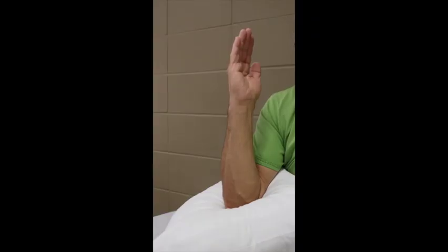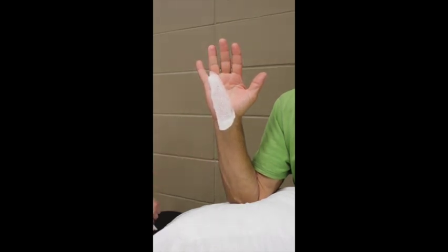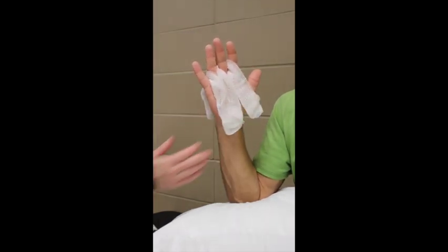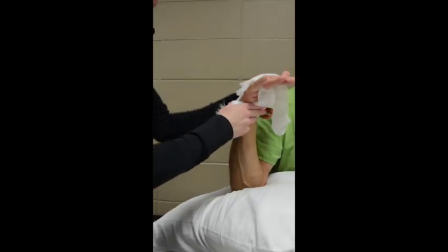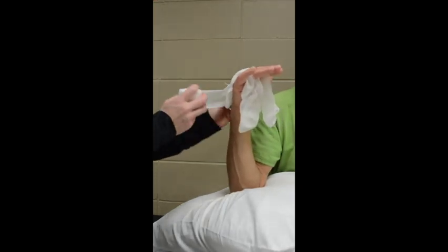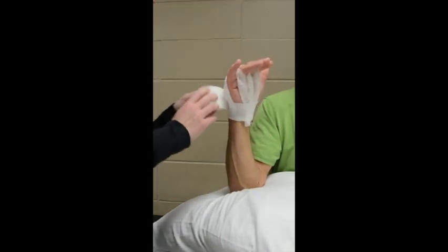To begin, position the patient in a comfortable seated position. This could be at a desk with the arm resting on the tabletop, or on top of a gurney or exam table with pillows under the arm for support. Start by placing padding between the fingers. Since all of the fingers will be included in this splint, we need padding between the four main fingers. We keep the fingers in slight flexion and try to keep the wrist in neutral. Most patients with a laceration will be more comfortable with those fingers in slight flexion.